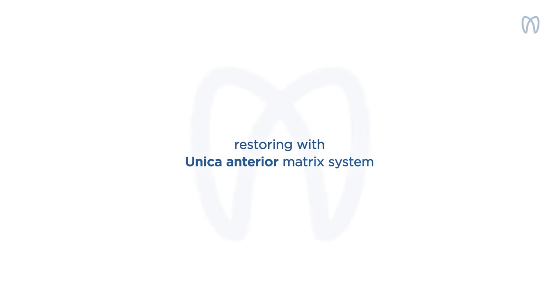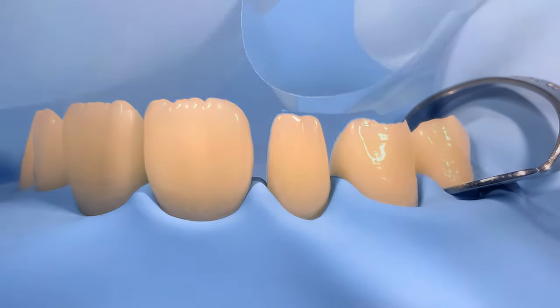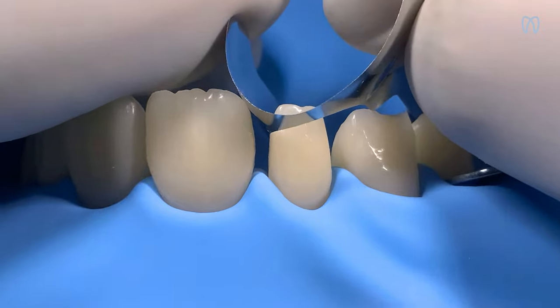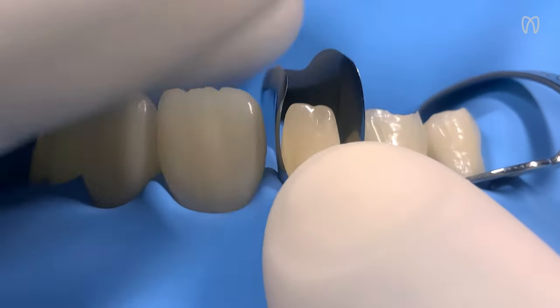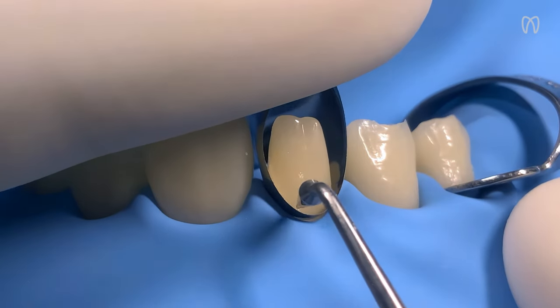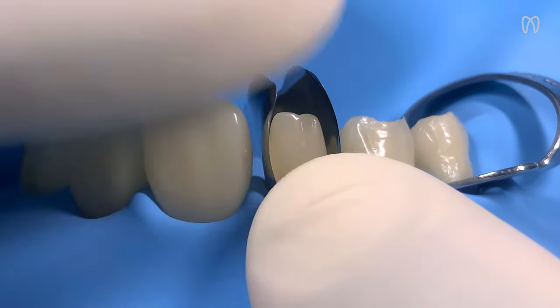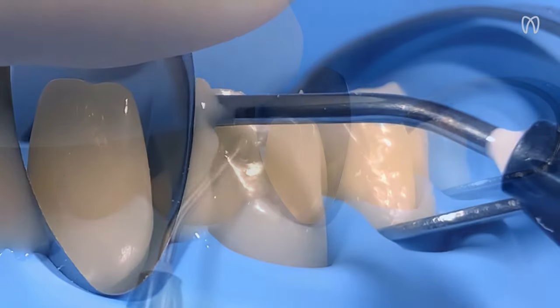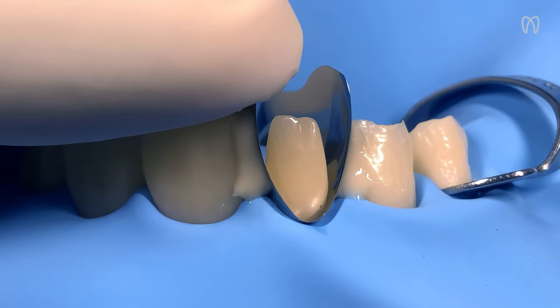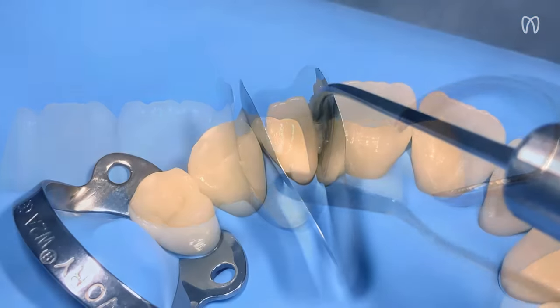Let's now look at an example of aesthetic and functional shape modification of a peg lateral incisor. For this case, we use Unica Mini Deep Anterior, specially developed to adapt to small anterior teeth. We insert the matrix comfortably through its positioning wings. Then, with gentle pressures on the cervical, distal, and mesial sections, we adjust the matrix and slide it into the sulcus. Unica Mini Deep Anterior allows great contour customization, enabling us to achieve predictable results and manage proximal and cervical margins easily with just one matrix.